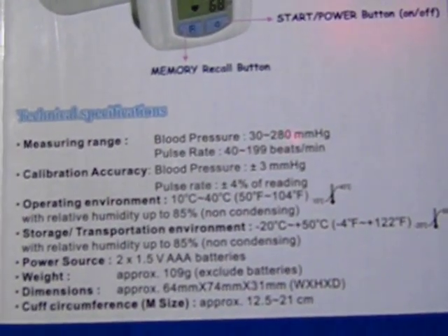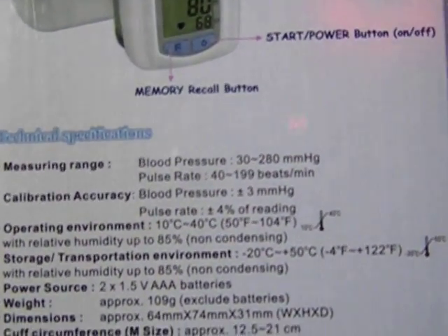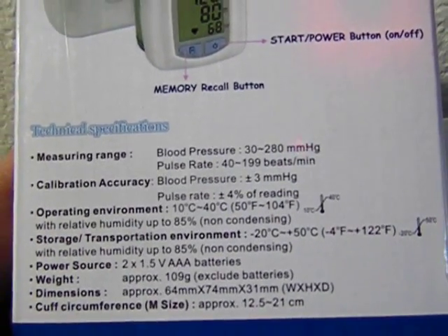It measures blood pressure from 30 to 280 mmHg, and pulse rate from 40 to 199 beats per minute.